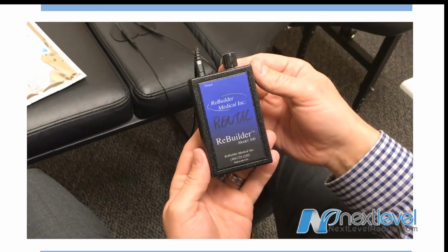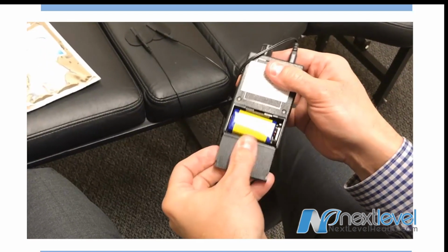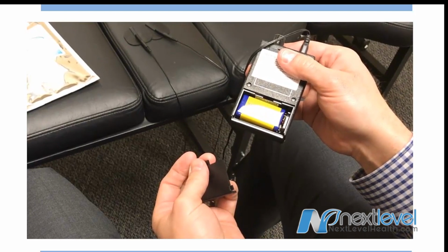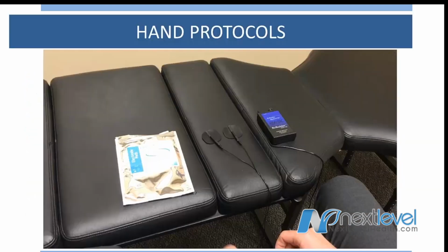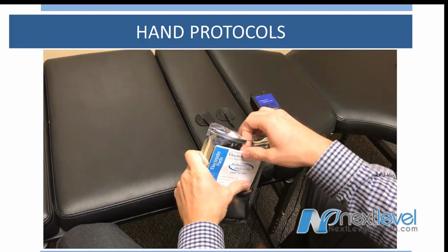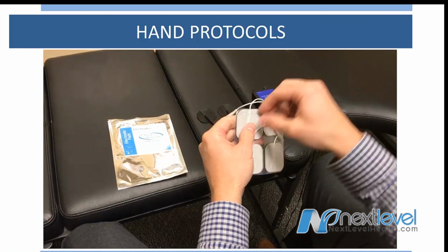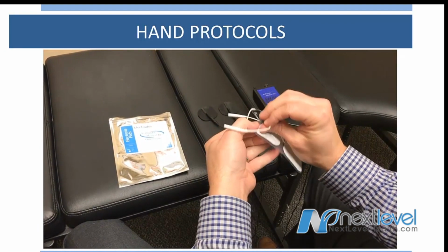Every 6 weeks, you'll have to change the battery on the Rebuilder. To do that, flip it over, remove the case. It takes a 9-volt. You are going to be using the sticky pads. These sticky pads are located in the silver pouch. Break open the pouch, pull the sticky pads out.